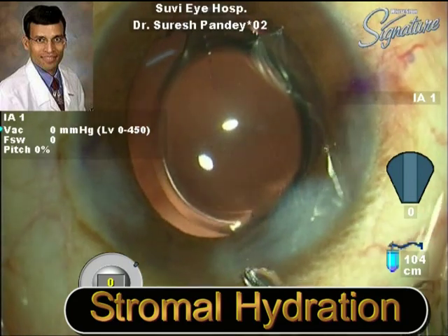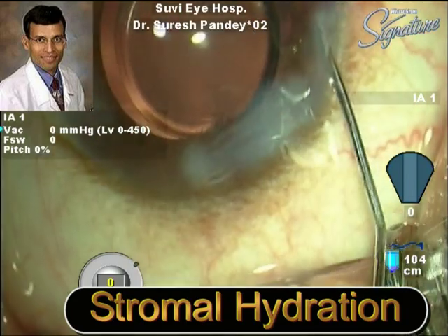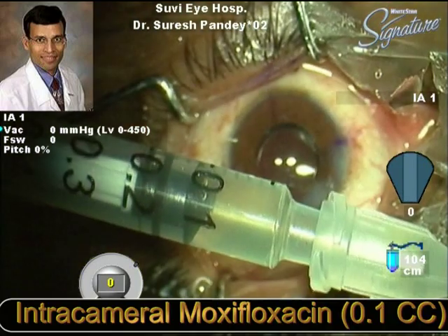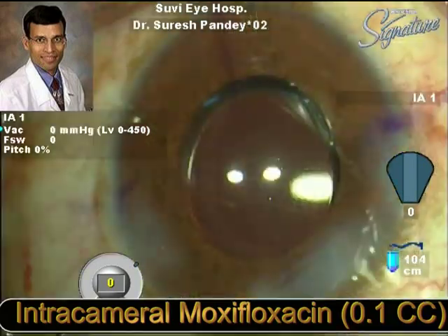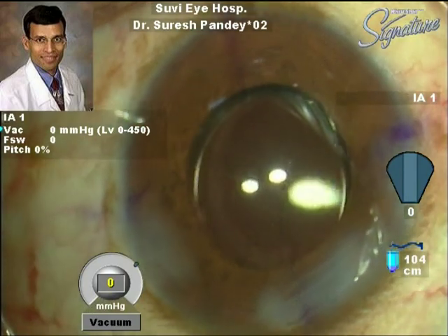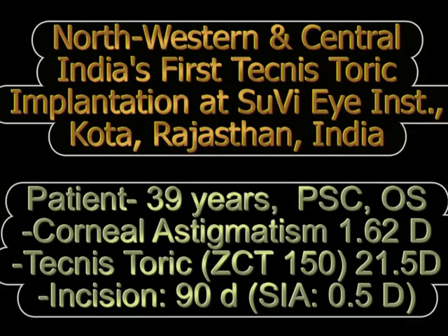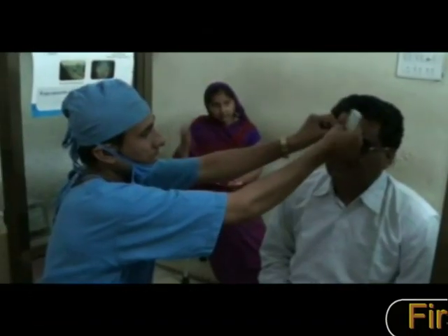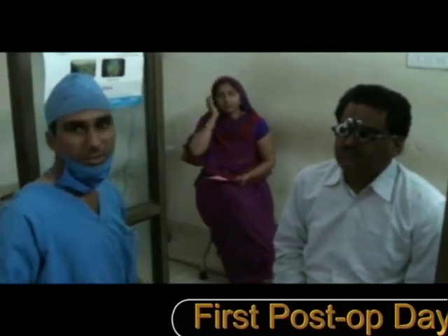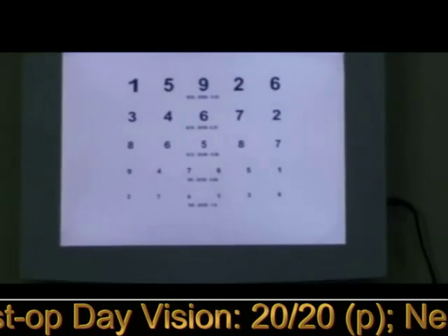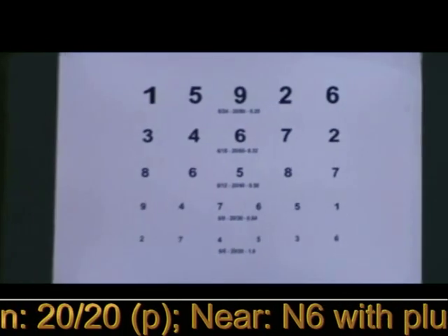The marks on the cornea are very well aligned along the astigmatic axis. The incision and side port are then sealed in the normal fashion, and as standard practice, intracameral moxifloxacin is injected into the anterior chamber. This was performed on October 9th, 2012, and post-operatively the patient had a vision of 6/6 unaided on the first post-op day, and N6 near vision with a +2.5 diopter add for near.